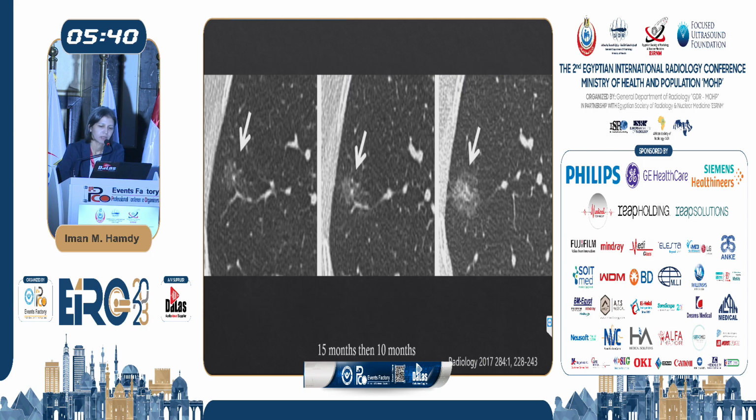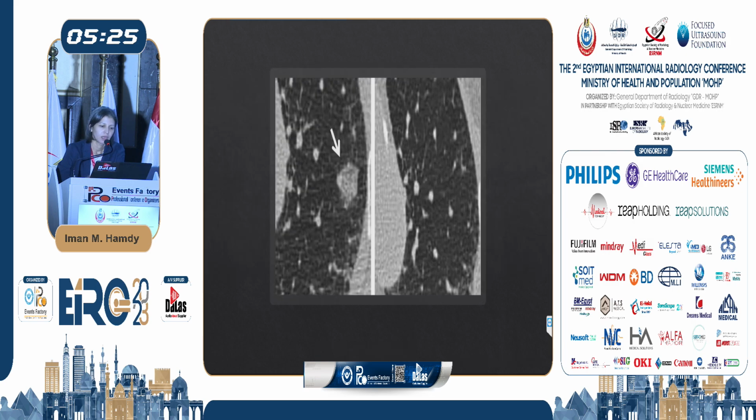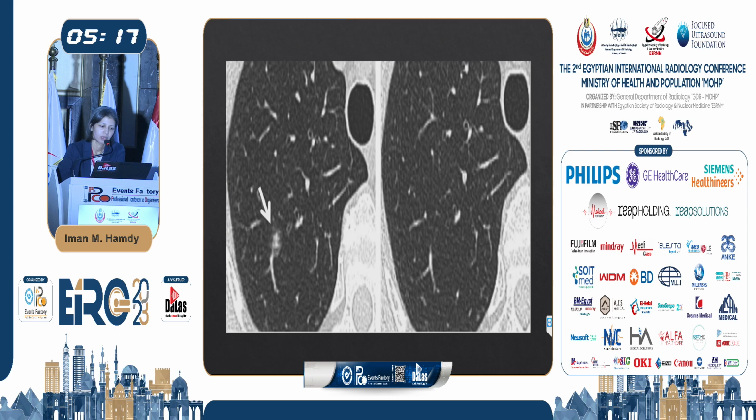The same increase in the size of the lesion in general, the solid and the ground glass component, and also the solid component more, with an interval of 15 months and then 10-month interval. Suspicious lesions with ill-defined outline, yet the follow-up showed total resolution. And another lesion that was focal infection and also total resolution.